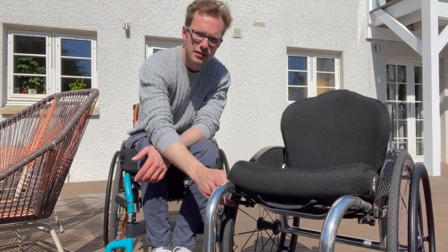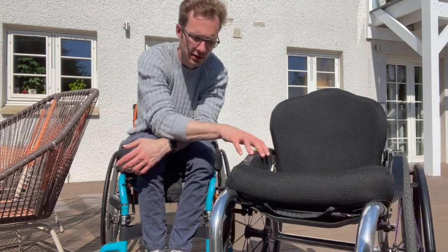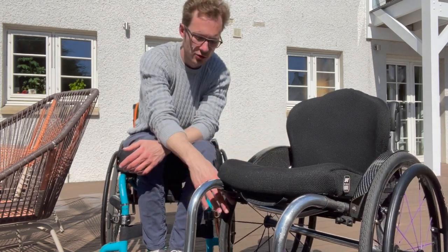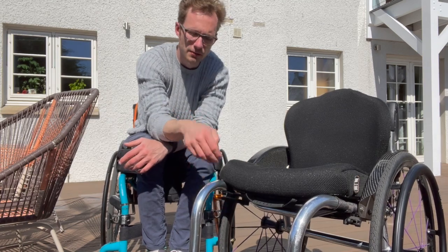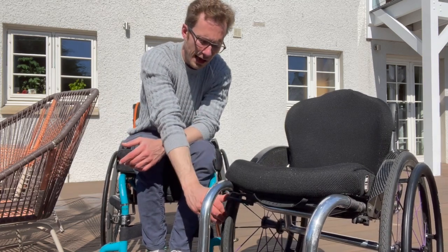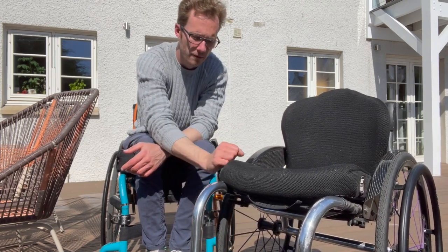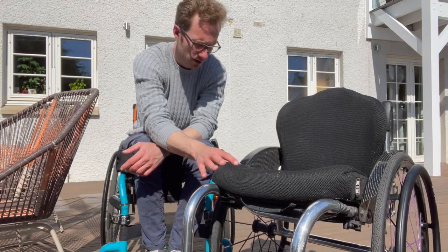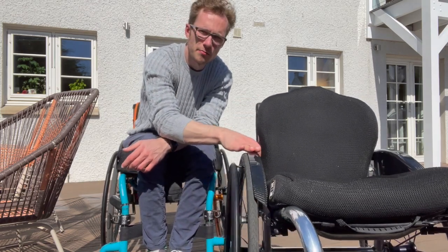Tucked in here are the scissor brakes. I've used a couple of different brakes on chairs and find scissor brakes to be best — they're quite easy to put on and off even if you don't have full hand control, and they tuck away nicely when not in use, unlike some other brakes which knock forwards and get in the way when you transfer.